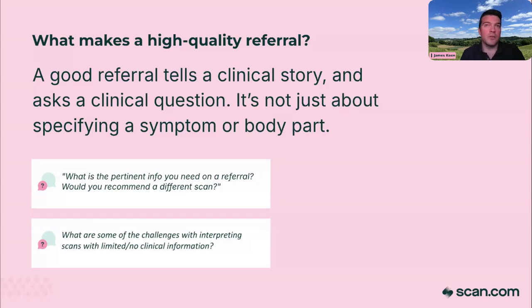I would say for an ankle, for a foot, for a plain film X-ray, the radiographer's not going to be overly concerned. If I was asked to do a CT abdo on a patient who turned up 7 months pregnant, then people are going to roll their eyes and go, why didn't the referrer think to tell us?